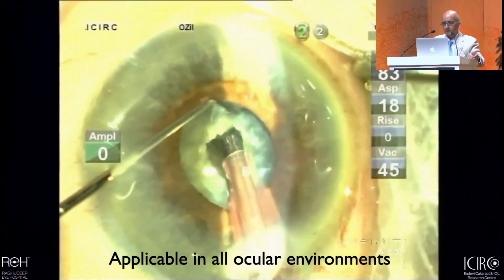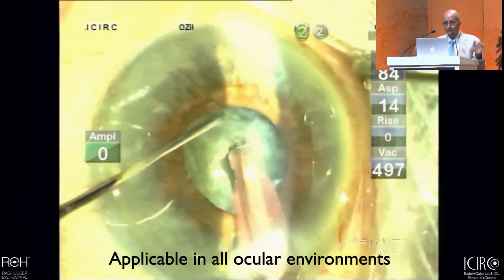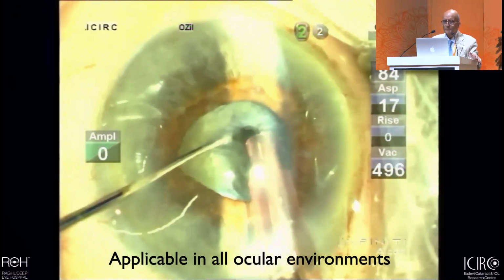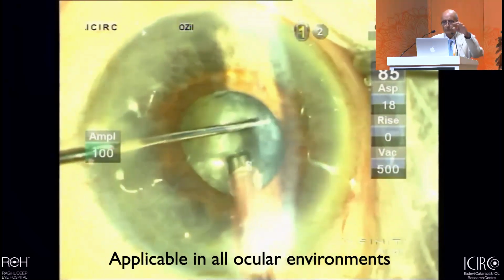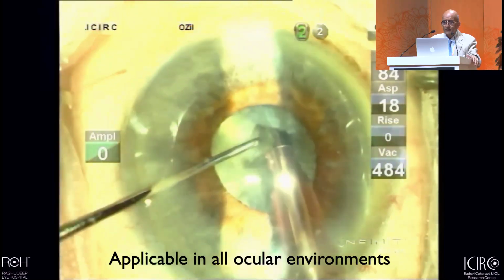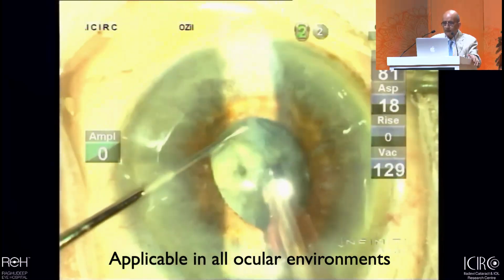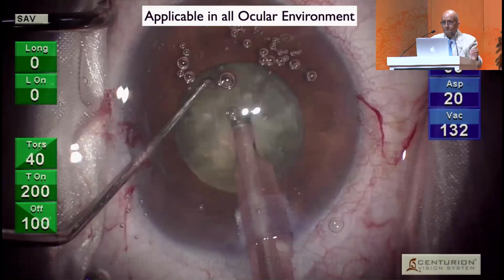I would recommend you to use the pupil retractors or a ring expansion, not this. No ego, but I'm showing you just to prove that this kind of movements is quite safe. It's not a blind procedure. You're able to see everything even through the small pupil, and you can achieve the goal of total division. Continue that 360-degree round and make as many fragments as you can.